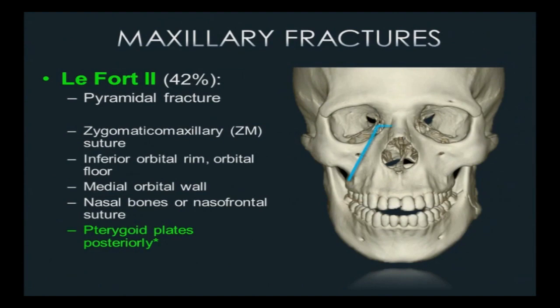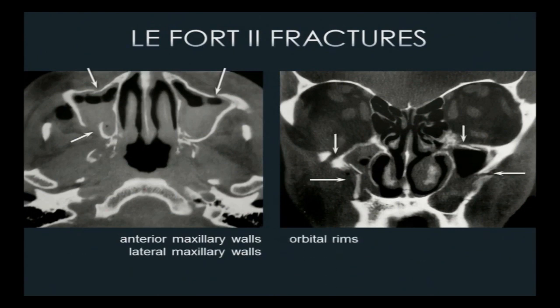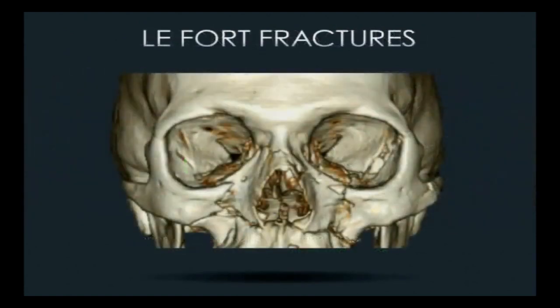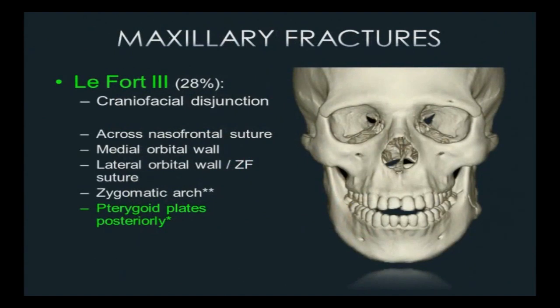The LeFort II pyramidal fracture goes up across the maxilla, crosses the medial orbital walls and nasal bones, then back down the opposite side, exiting through the pterygoid plates. On axial images we see fractures through the anterior and lateral maxillary walls, extending through the inferior orbital rims as it ascends across midline and back through the pterygoid plates. On 3D CT, the surgeons get the big picture — the LeFort II pattern following the rules clearly, with the global view needed to understand where all the fragments and fracture lines are.